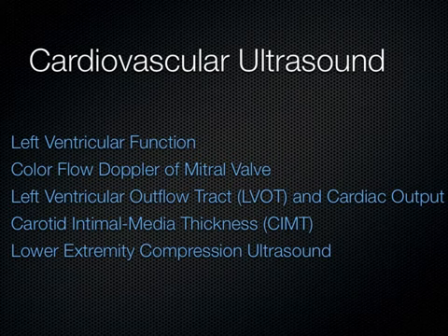And then we're going to talk about how the carotid intimal medial thickness is a surrogate marker for multivessel coronary artery disease, and also for strokes. And then finally, we're going to go over lower extremity venous compression ultrasound to rule out blood clots in the legs.